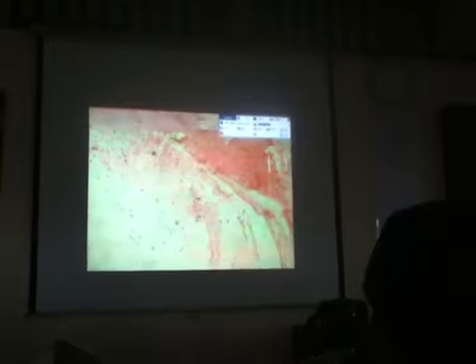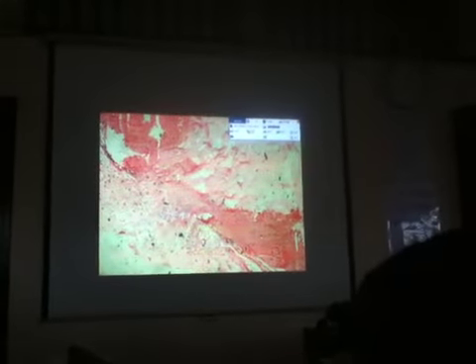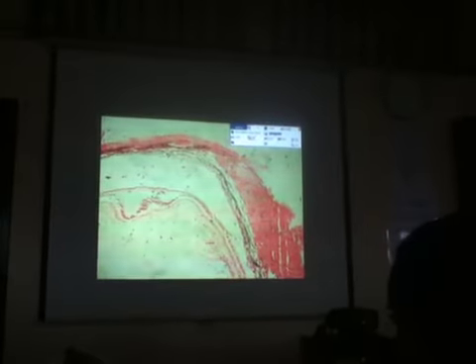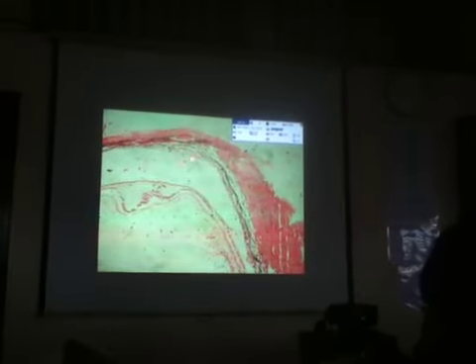Very good. As you can notice, up to there you have the ganglion cells, bipolar cells, rod cells, and cone cells. Upon reaching the optic disc, there are no more rod cells and cone cells, so nothing is able to capture visual stimulus at the optic disc. So we are seeing the optic nerve in its longitudinal view. Longitudinal view.